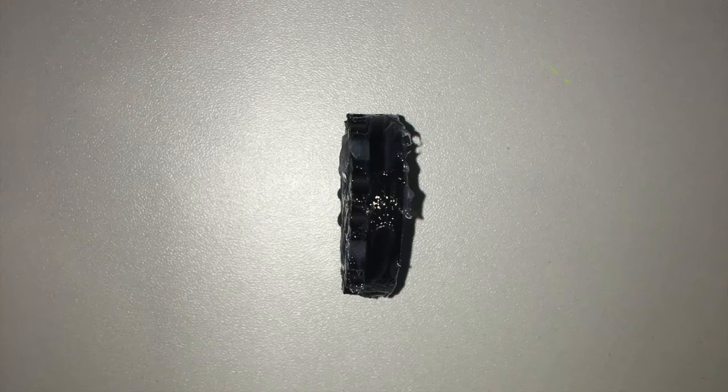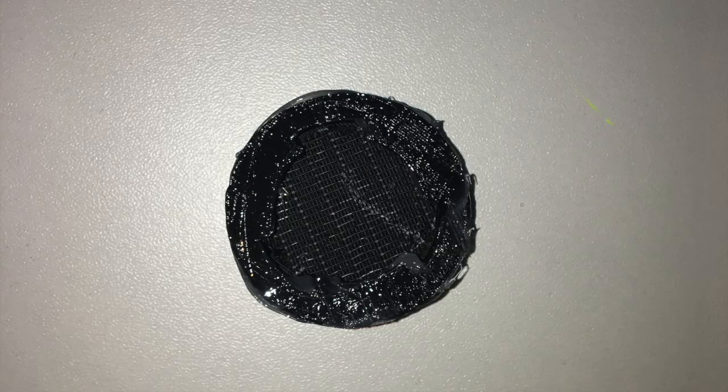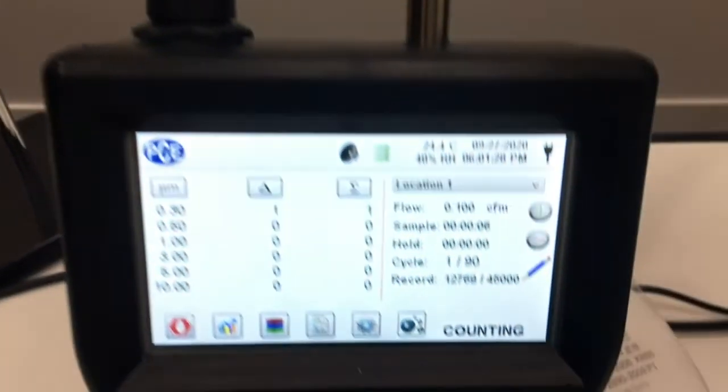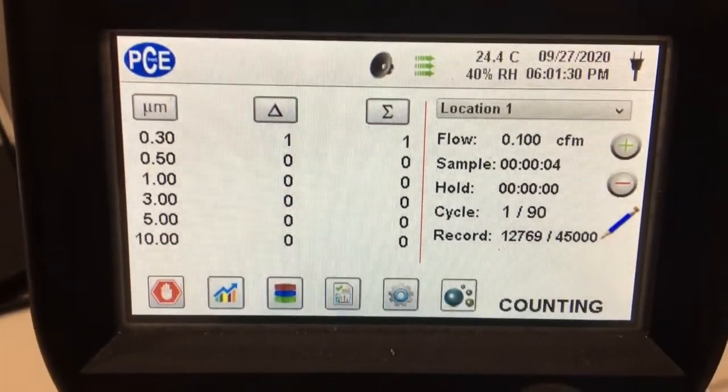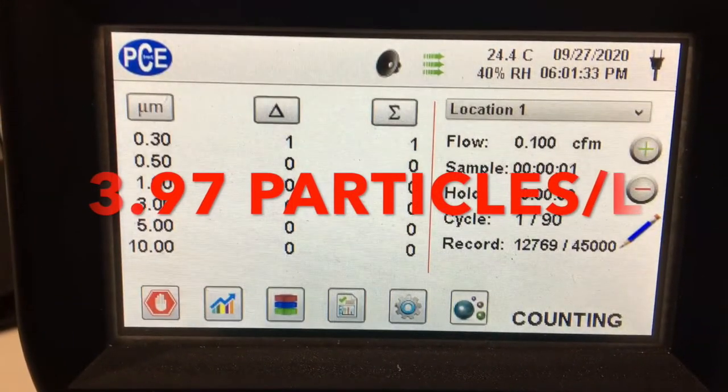As promised, you can see that we sealed both the plug and the adapter with a silicone-based caulking. We used the same Darmidtronic filter, which is an excellent filter with a 99.97% rating, and we caulked the actual filter to the adapter. With the same 6800 mask, we got an average of 3.97 particles per liter over 90 trials.